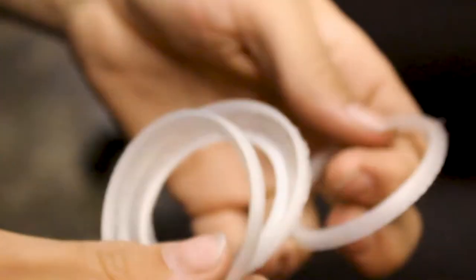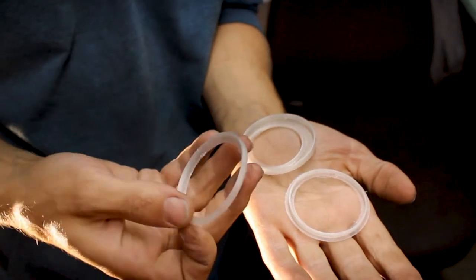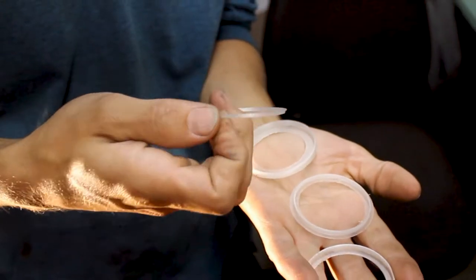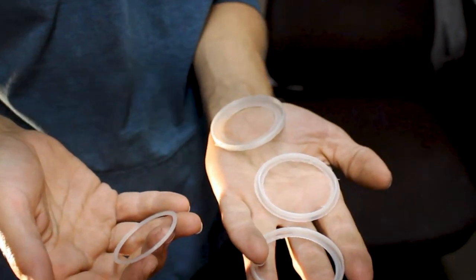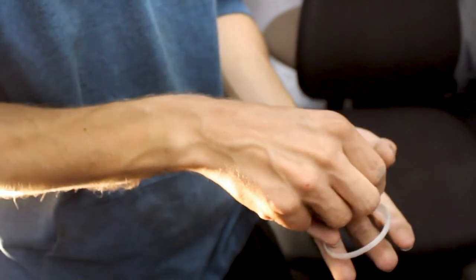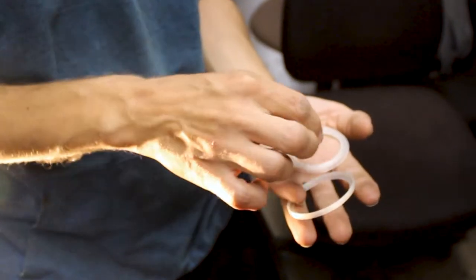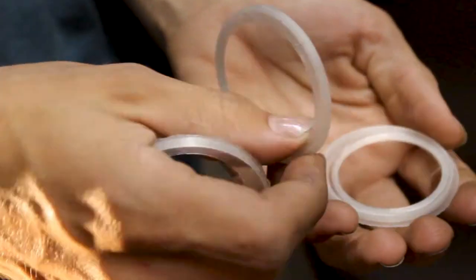So we have all our different parts. This is, I call it the ring holder. This one. Oh, I'm missing a part. Oh, bummer. Yeah, I'm missing a part. So there's one that goes on the inside, and one that goes on the outside, and then another one that goes on the outside to really secure it and make a nice seal. But it looks like I have to print another one, so I'll do that here in a little bit.